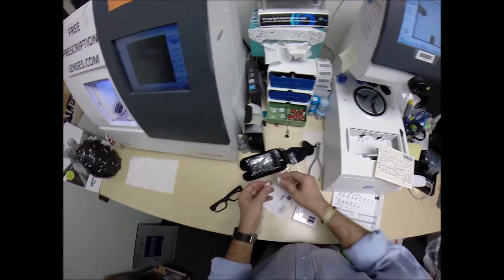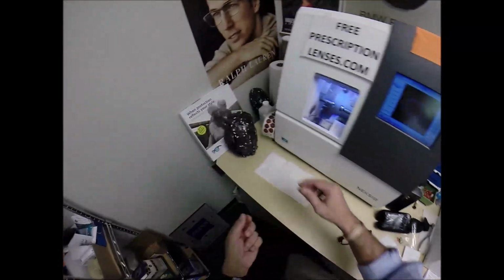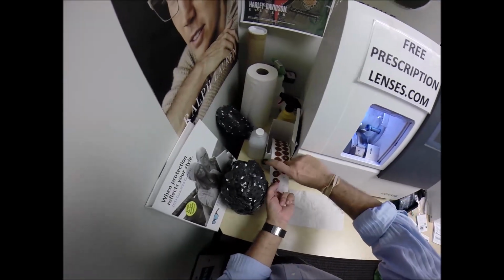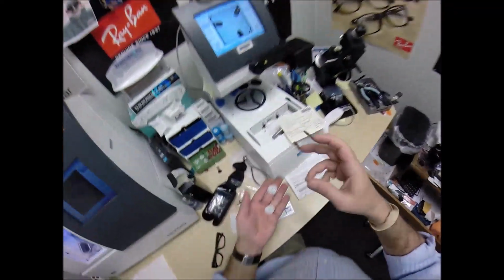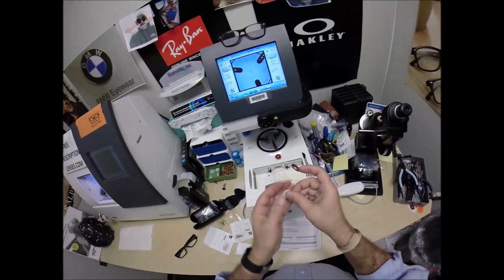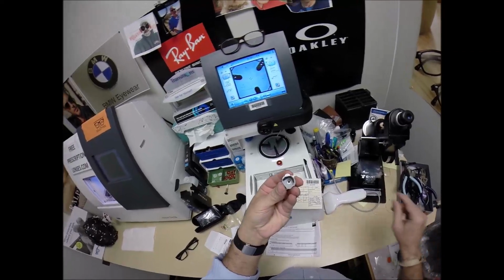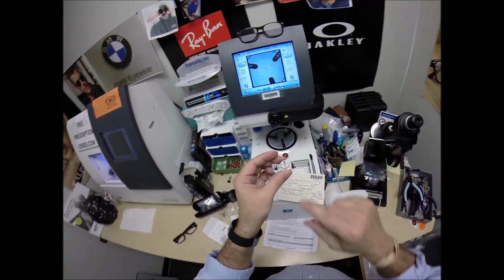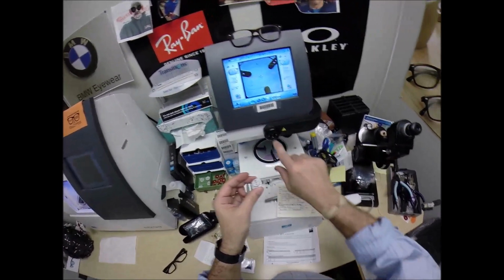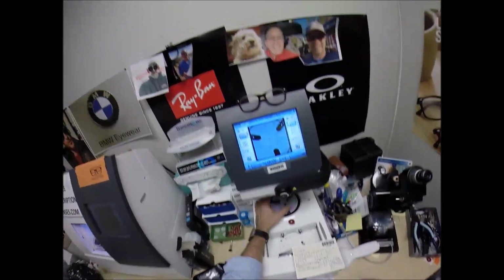I need 2 blocks, or as I like to call them, Jenny from the block. I need to attach 2 double-sided adhesive stickers, of which I've got them here. The black side is the sticky side. I'm going to line this up onto the first one. Do the same thing now for the second one. Pull the paper away to make the black side sticky. On the back is a silver button. That is a magnet. This is going to do its job twice. The first time it's going to attach itself to another magnet there in the arm.